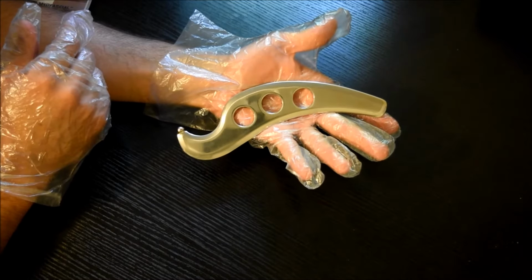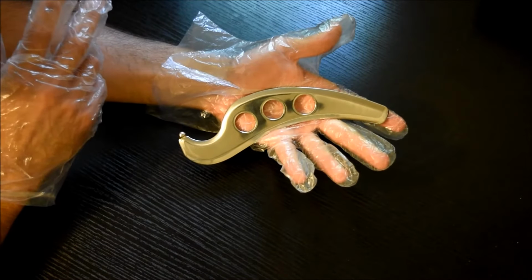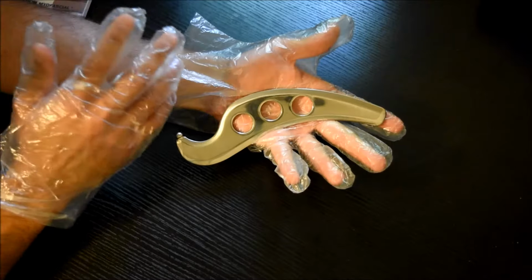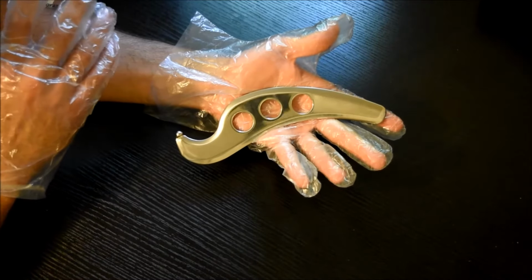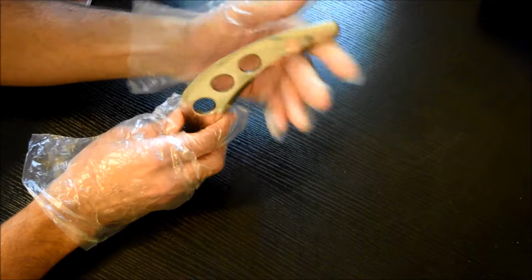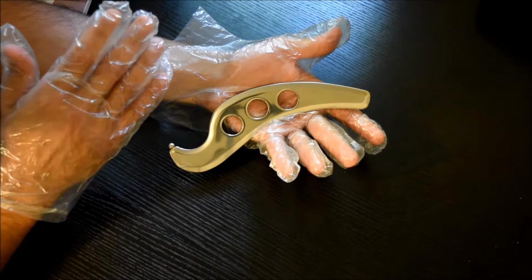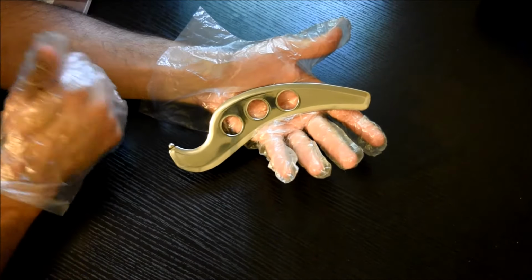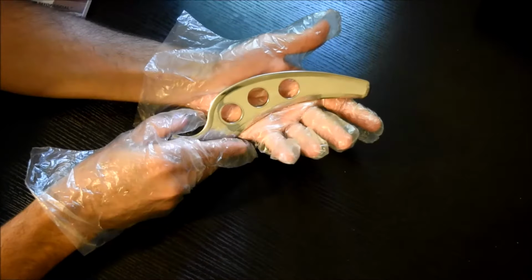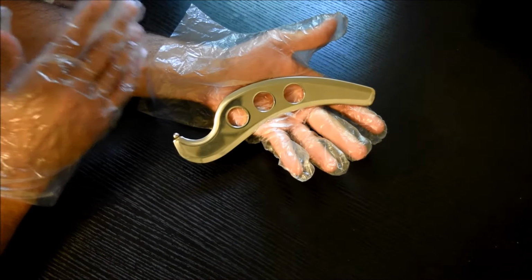Now, a lot of you might be wondering, why don't you just use your hands for fascial mobilization? Well, your hands and your thumbs play a very important role in fascial mobilization, and you can do a lot with pin and stretch or active release technique. But what we're doing here is using the specifically beveled edge on the stainless steel instrument to mobilize the superficial fascia, which plays a very important role in the recovery and mobility of a patient. Foam rollers are great. Using your hands is great for loosening up fascia that is deeper. What we're focusing on here is the superficial fascia and using the bevel to loosen it up. It's something that our hands cannot do the same way.